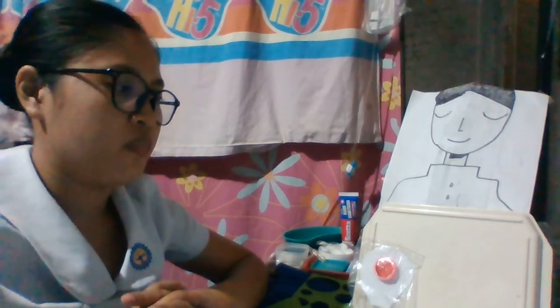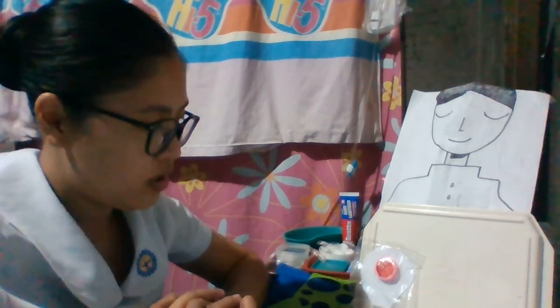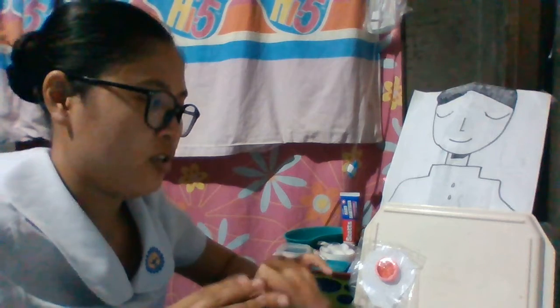So the stoma should be red and moist, and the size is round. There are no other adverse problems other than that, and there's no bleeding during and after the colostomy care and changing of the pouch.